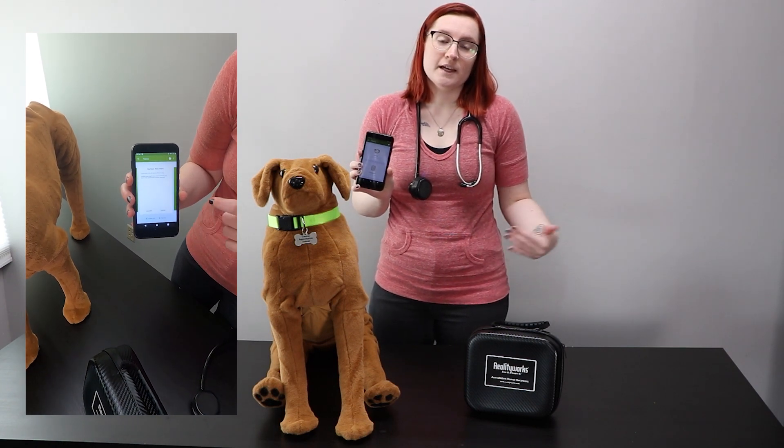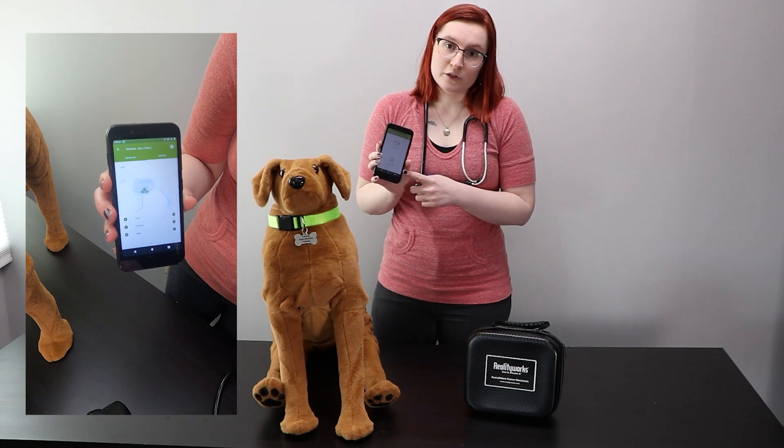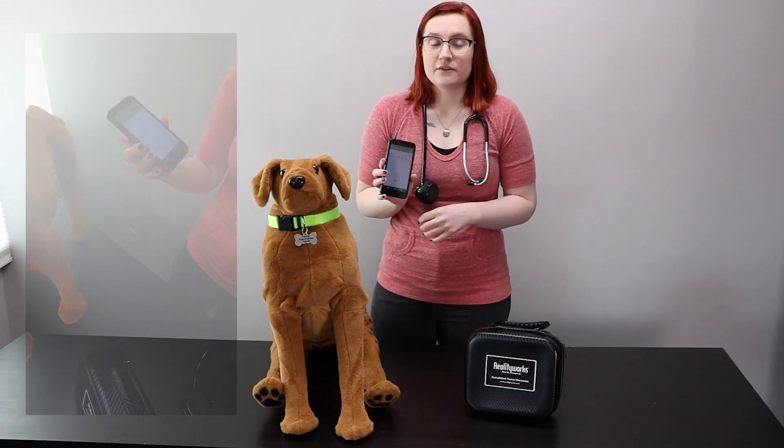They'll also see more information about what that sound means for the animal. We also have assessment mode where students have to auscultate for and identify the sounds all by themselves, with no guidance from the app.